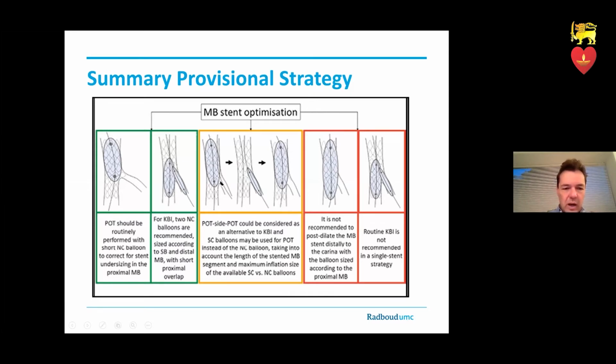That's the only way to push out the struts which are in front of the side branch as much as possible into the side branch. In that way, you increase the area of the cells in this entry area for the side branch. So in this case, the marker is there, but you can see this one has much more shouldering than the balloons we have in practice, which have a very strong shouldering, but some more overhang in here.